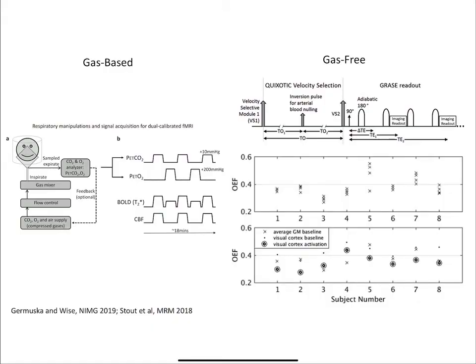The other thing that's really kept these methods from emerging or being more widely used is because to really do it right, you have to have people breathe carbon dioxide as a calibration method. So this is for calibrated fMRI.